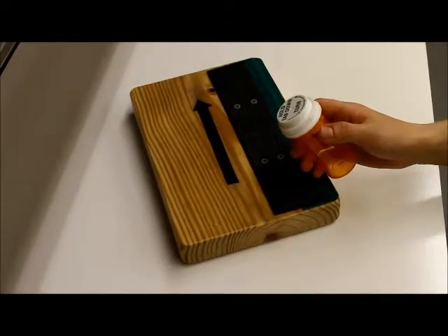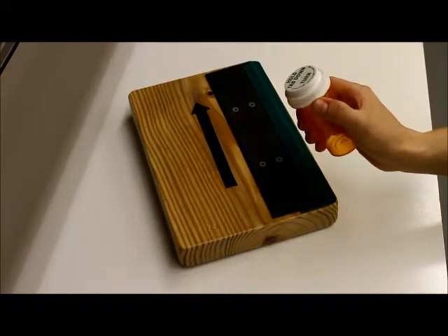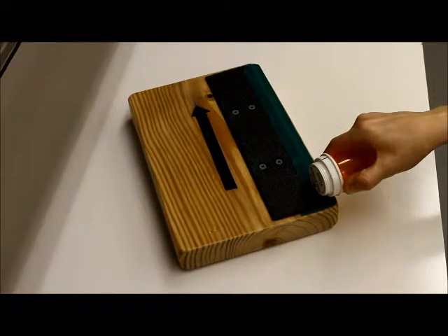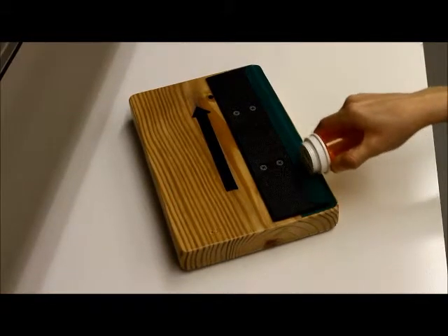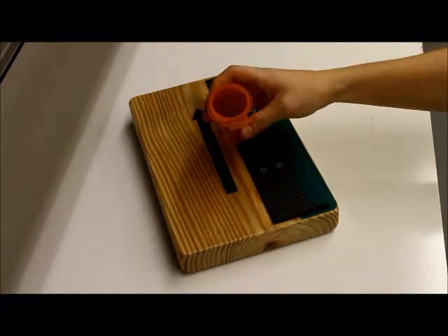In order to utilize this device, simply depress the tab with your thumb, set the side of the lid on the green ledge, and gently drag the pill bottle in the direction of the arrow. The lid will twist off and fall onto the wooden platform.